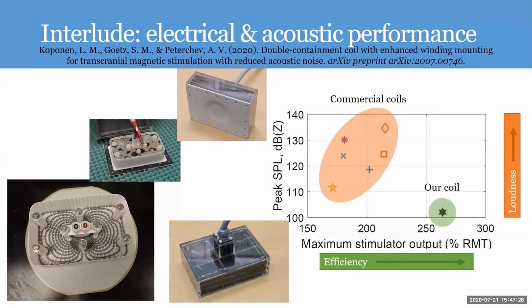So this is the result that I had that was supposed to be for a conference in March, but well, then 2020 decided to intervene. So I have actually optimized a next generation of the windings and how to pot them. These 4 holes are no longer needed, so I can remove them and increase the efficiency by a few percent on the windings, which also will increase the stiffness of the potting because it won't have those mechanical compromises.